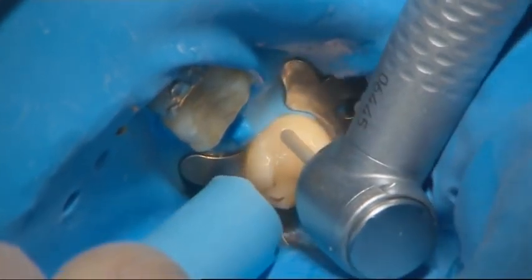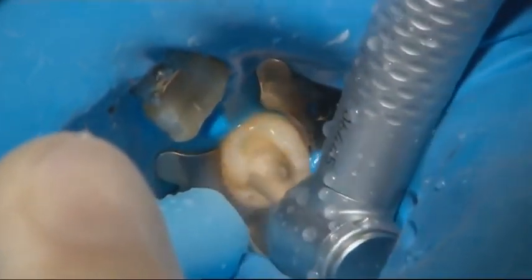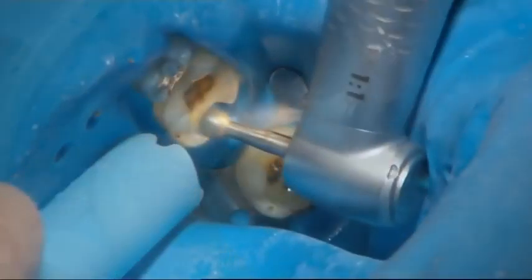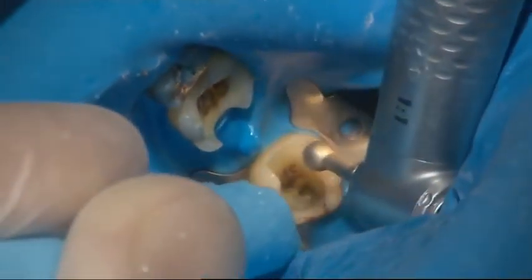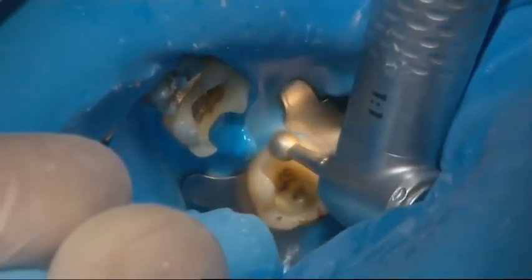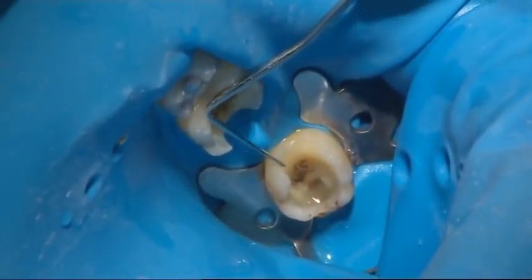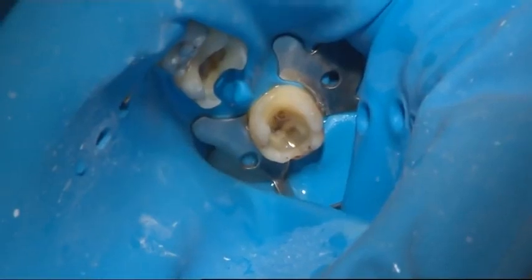Any existing fillings are removed to create space for the fibre frame and layering composite. The required length of fibres was measured to make the fibre frame. The required length of fibres was cut together with the silicone bedding. The cut fibre pieces were shielded from the light until needed.